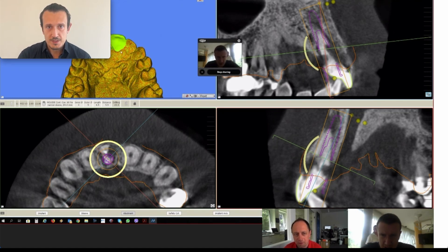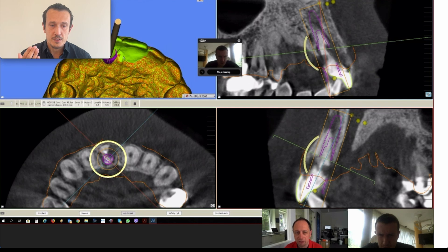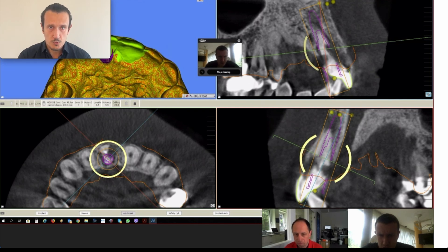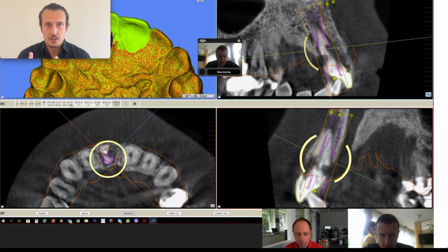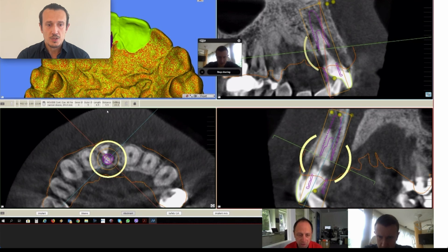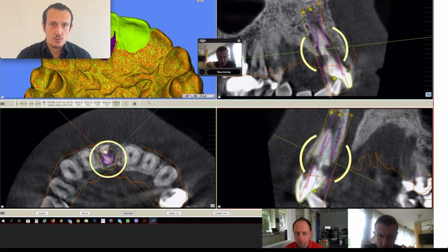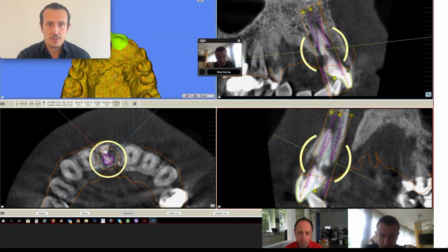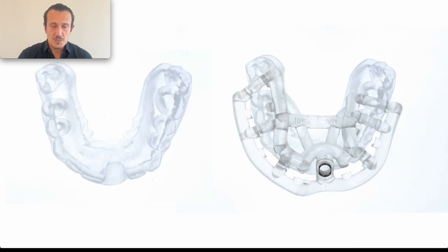Additionally we're looking for the access hole in order to create a screw-retained restoration if possible, because this is my preference. I also don't want my transmucosal components going close to the papilla or to the buccal area; if I go too much to the palate, the crown will be too thick on the palate and the patient will need to get used to this — I have a lot of complaints from patients when the palate part of the crown is too bulky.